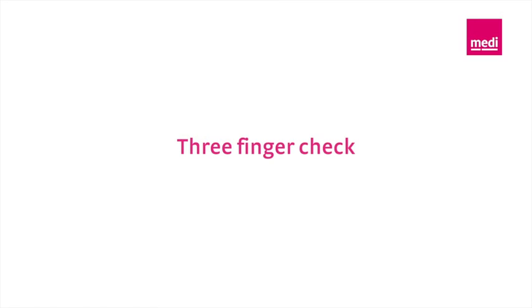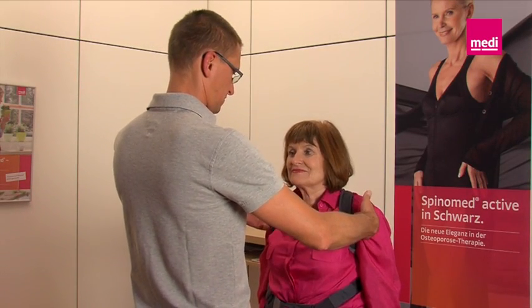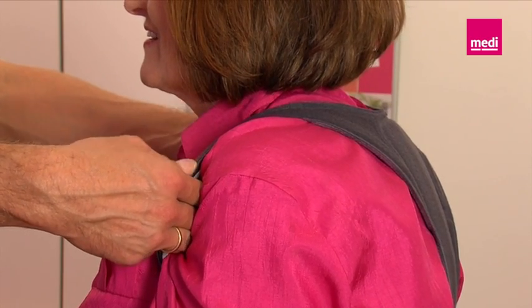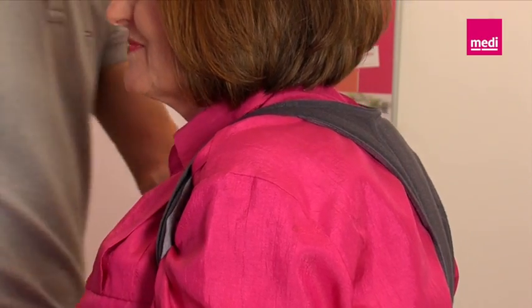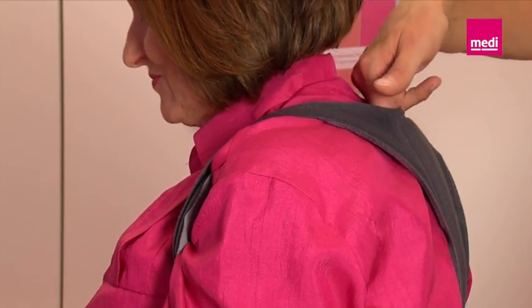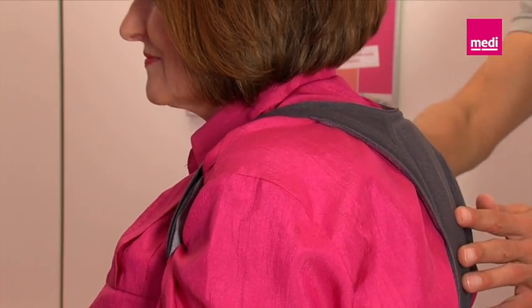Three-finger check. To avoid constrictions, check that the brace is correctly adjusted by seeing whether you can slide three fingers between the shoulder strap and the shoulder of the patient. Secondly, use three fingers to check the distance between the neck and the upper edge of the brace. This ensures that the patient has enough room to straighten up while wearing the brace.